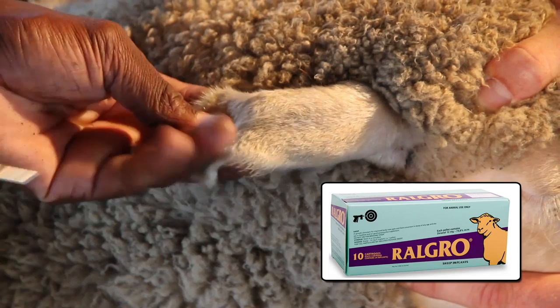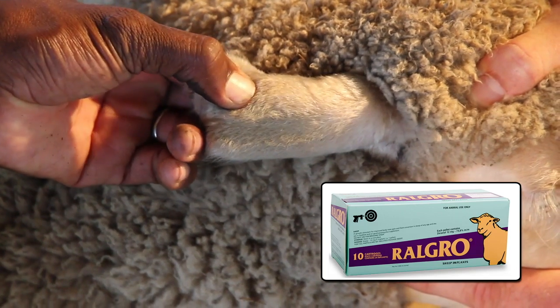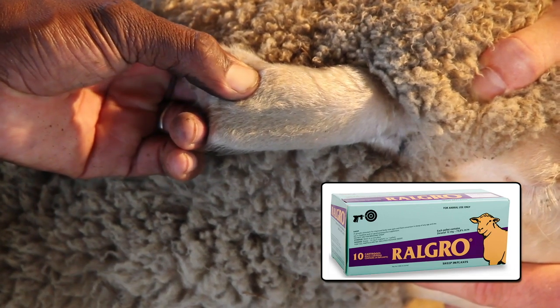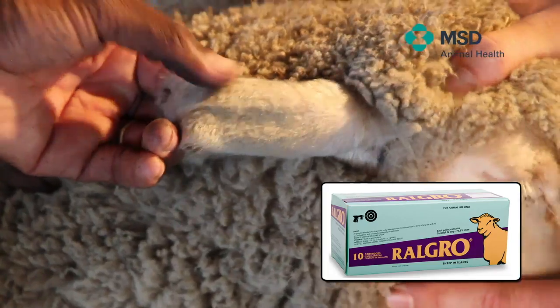After removing the needle, pinch the hole for a few seconds to make sure that the hole is closed so that the implant cannot migrate out.